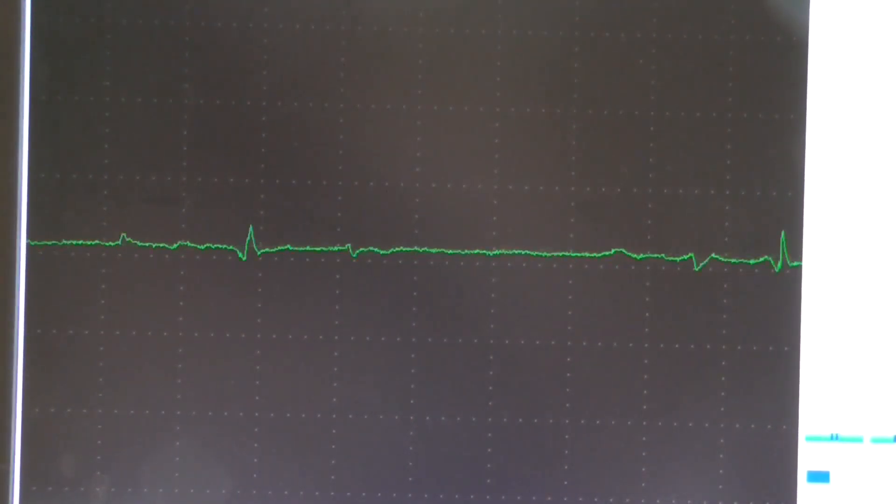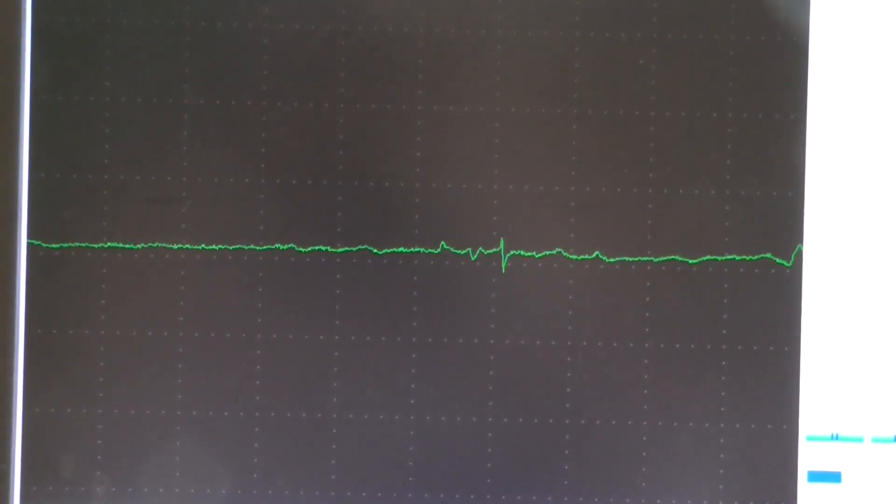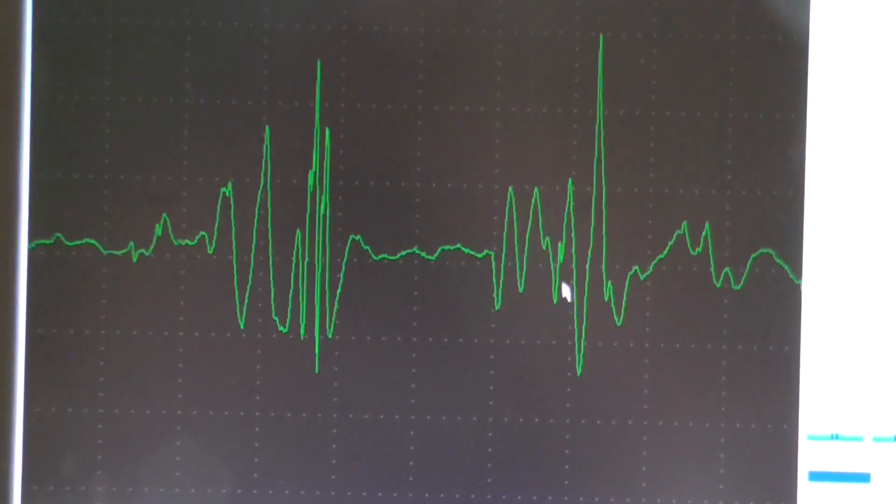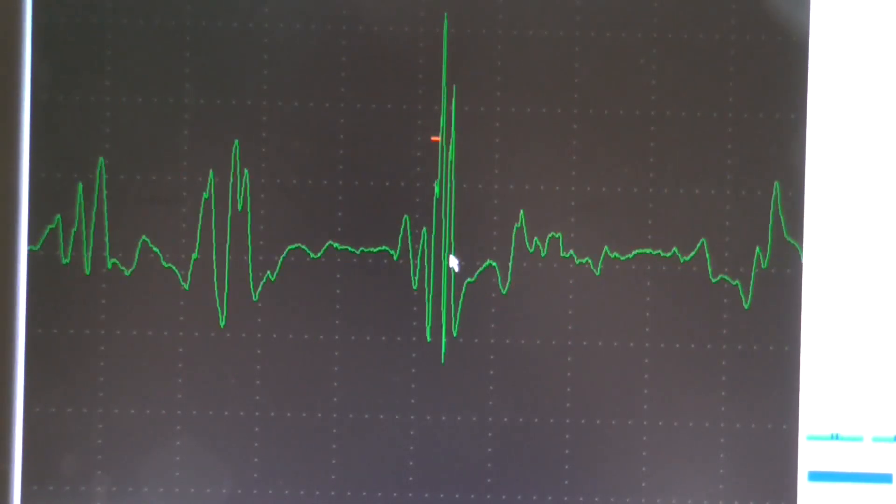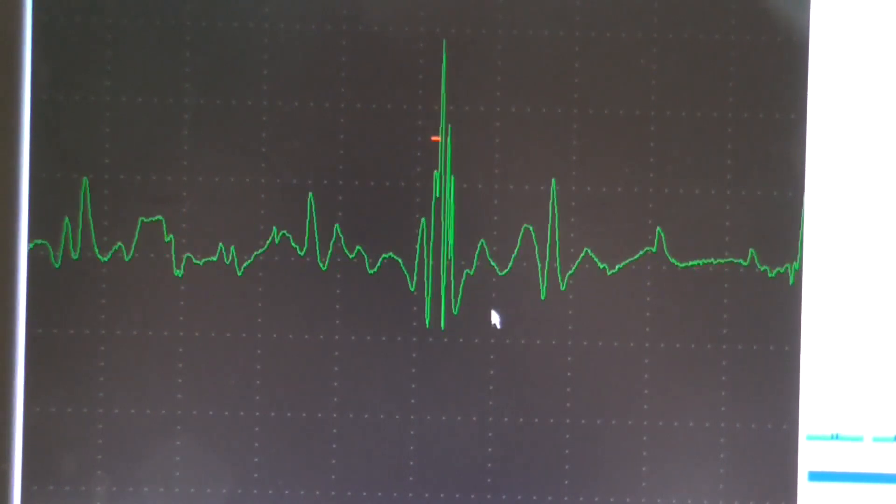So these little tapping, popping sounds, these are all fibrillations over here. Then these polyphasic units, which we'll lock onto here. You can see lots of different shapes to them.